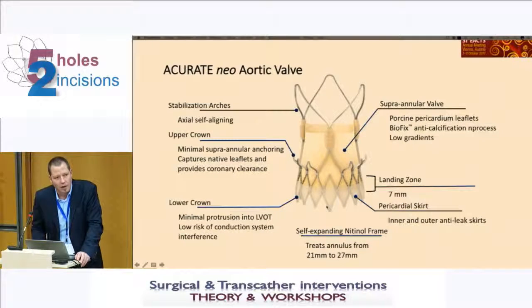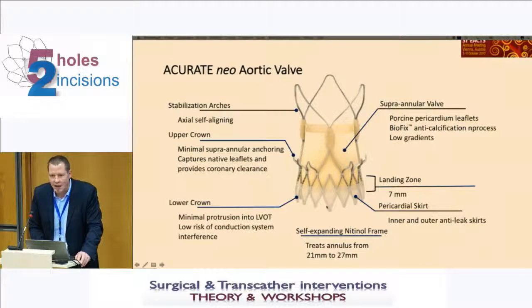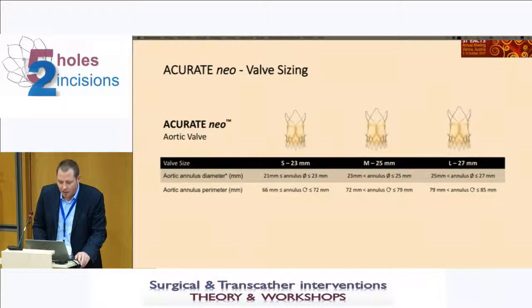is going to become available early next year as an active seal version, where they add a kind of adaptive seal around the stent edge here to improve PVL. So all the companies are following more or less the same route to get better results in regard to PVL.